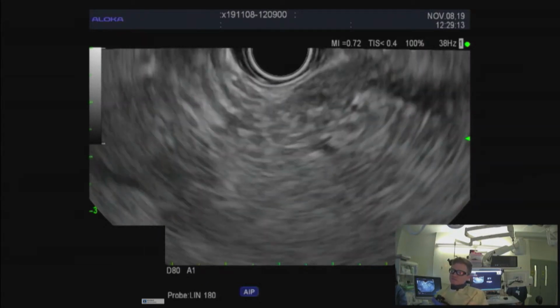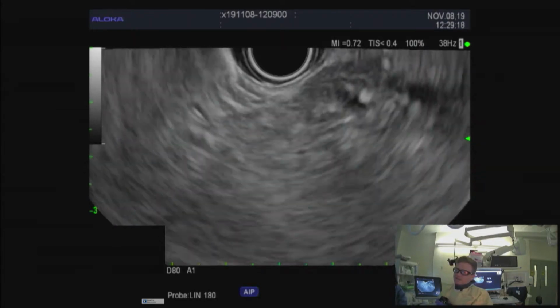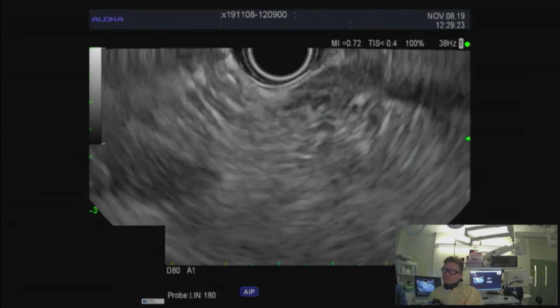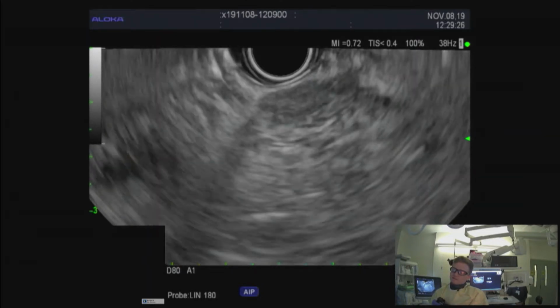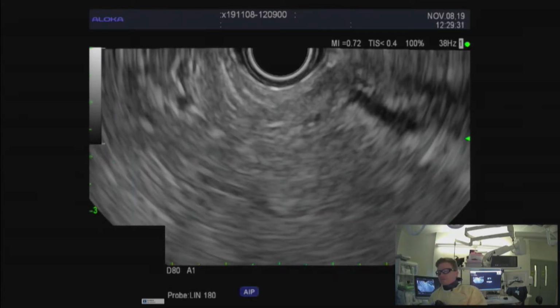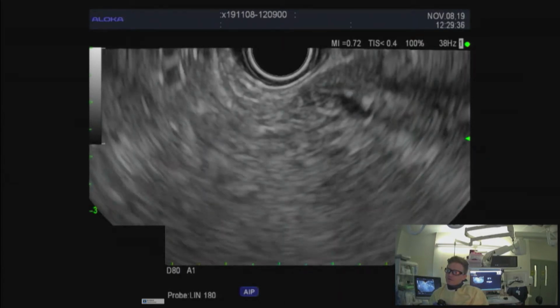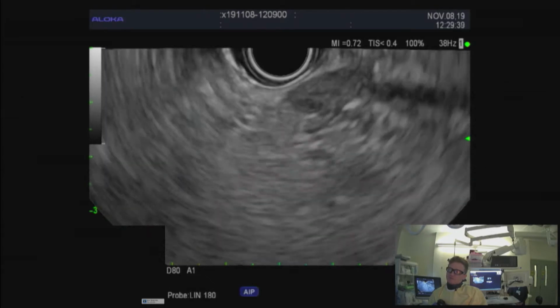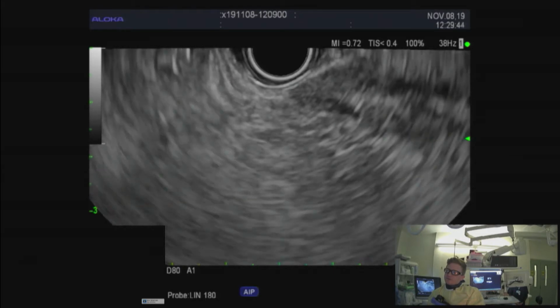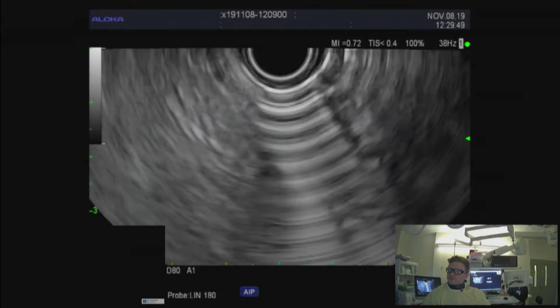And this case, I think, is a good demonstration of the fallibility of the ASGE guidelines still. So it's important to keep in mind that even with the stronger predictors in this setting, in this case the bilirubin above 6, only about 45% of the time are stones actually seen at the time of ERCP. So, our standard practice is to do the EUS to clear first to spare potential cases of pancreatitis. So for this patient, of course, I think we'll just stop, and the next step will be cholecystectomy.